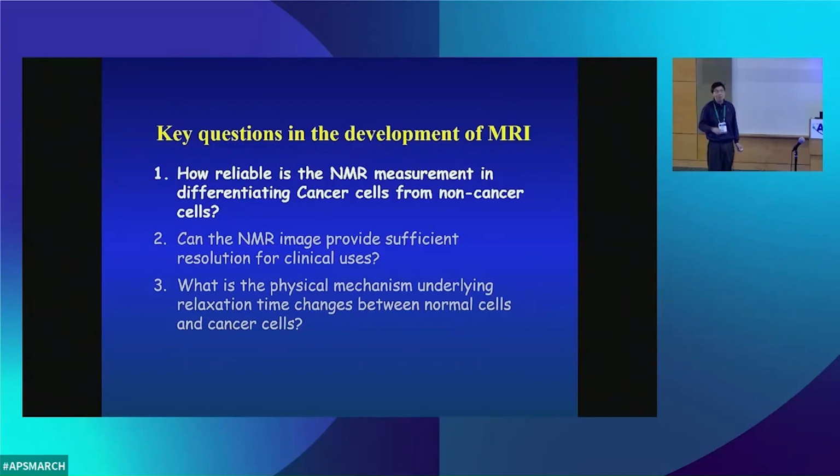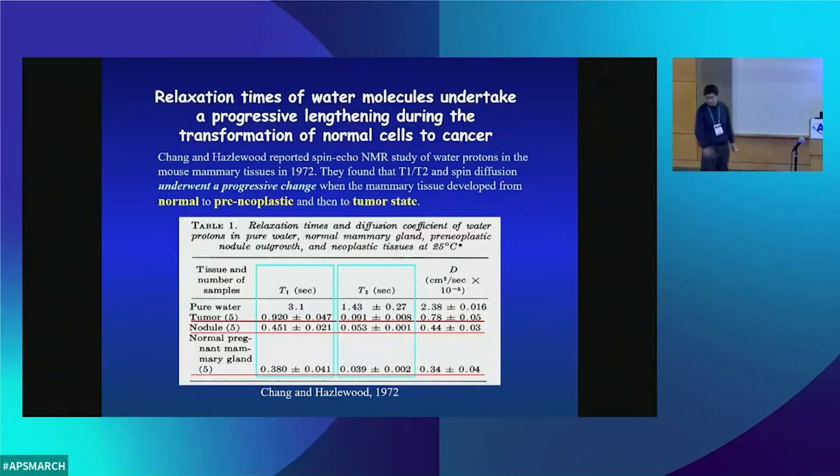Particularly, I remember a scientist from Johns Hopkins University, Donald Hollis, has written several papers, later even a book, saying that the T1 lengthening could be caused by multiple other things, other than cancer development. So T1 lengthening alone is not sufficient to say whether this is a cancer cell or not. Now, in our case, we do more than the median, of course.